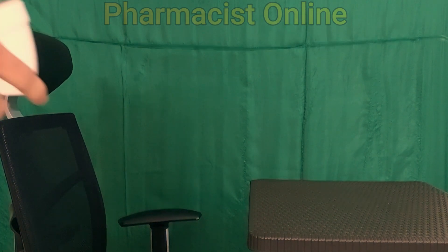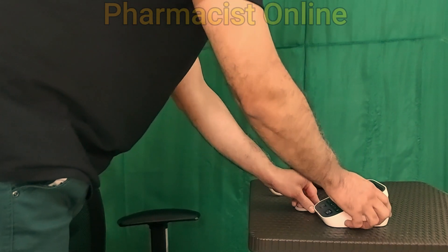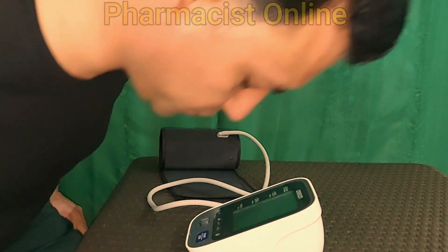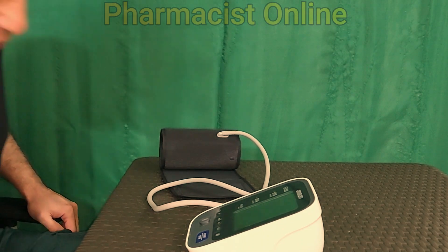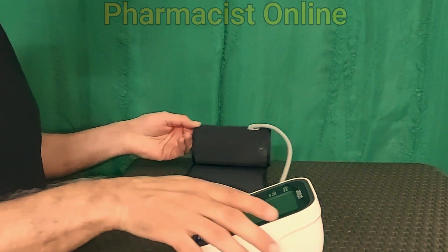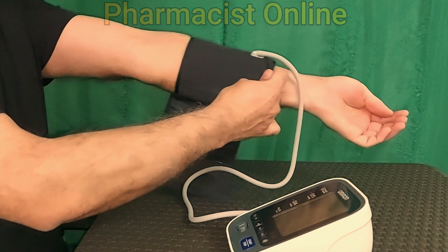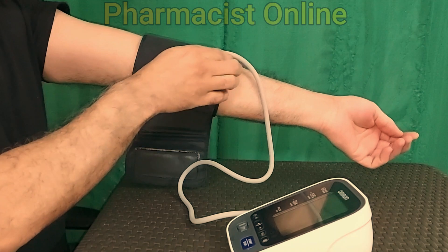While taking blood pressure at home using a digital blood pressure monitor, keep the BP monitor on the table and sit on a chair. Sit relaxed and keep your legs uncrossed and flat on the floor.